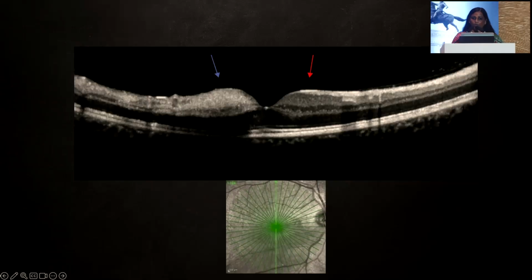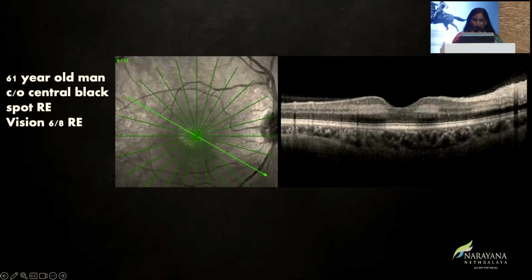Similar thing if it happens to one branch, that's a BRAO. Sorry, I said BRVO, I'm sorry about that. In BRAO, you have the same thing, ischemia, therefore whitening of the inner layers, darkening of the outer retina, and you see a normal retina on the other side.